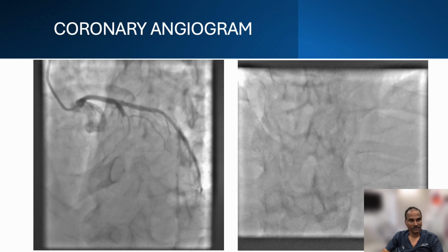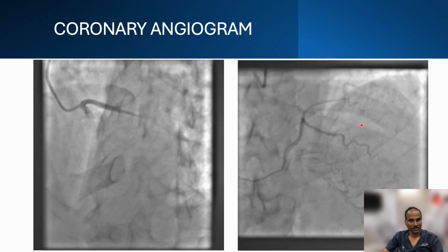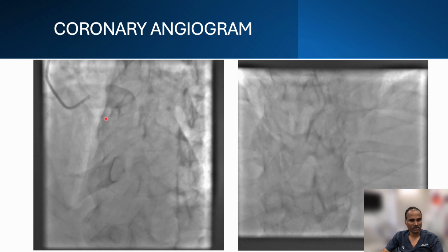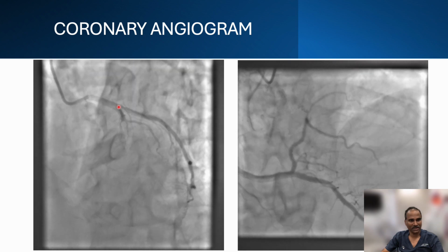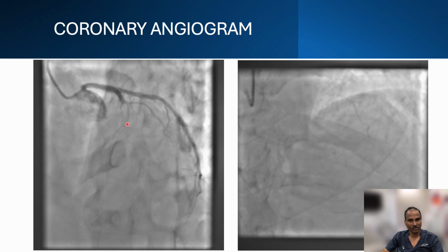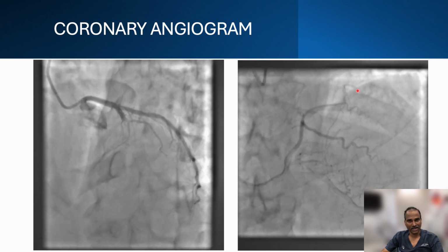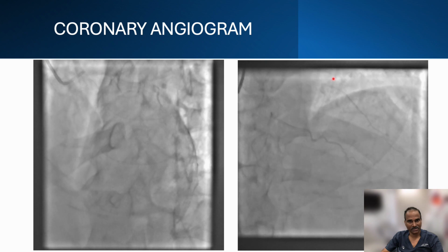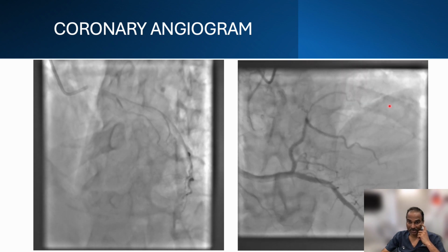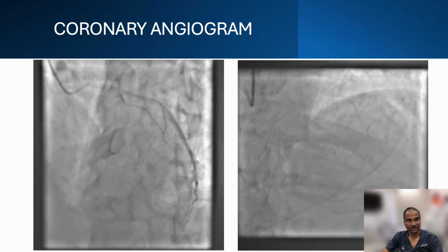This is the RCA injection showing distal flow into the LAD, and it looks like around 20 millimeters in length, but clearly the proximal cap is ambiguous. You can also notice a branch at the distal cap. There is a bifurcation even at the distal cap, and a big diagonal sitting there.